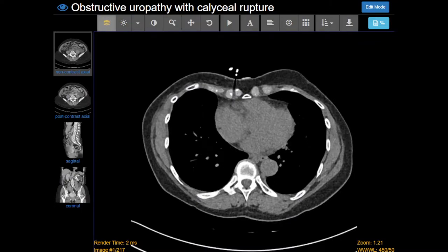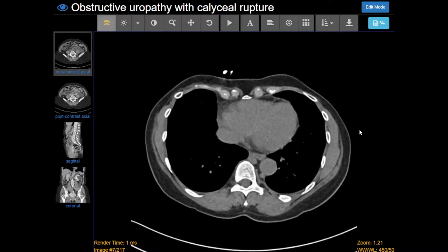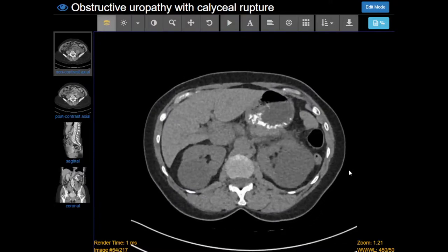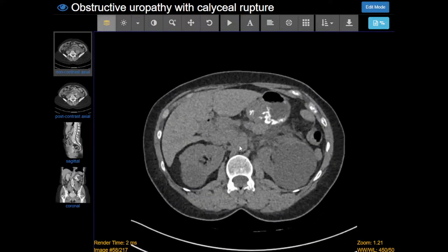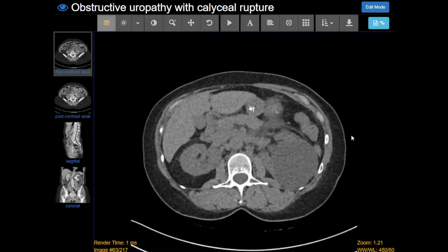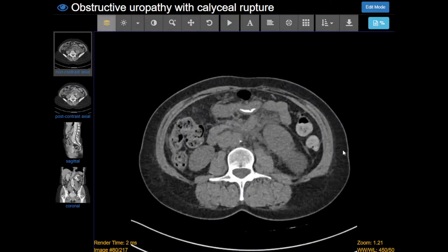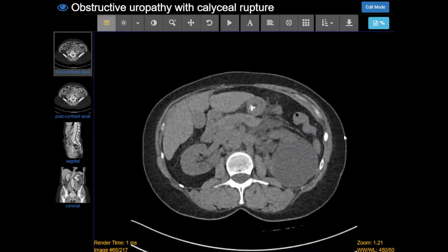This is an interesting case of an obstructing kidney stone with caliceal rupture. We have a non-contrast CT of the abdomen and pelvis. You can tell it's non-contrast because there's nothing in the aorta or other blood vessels. This is the best way to look for a kidney stone.